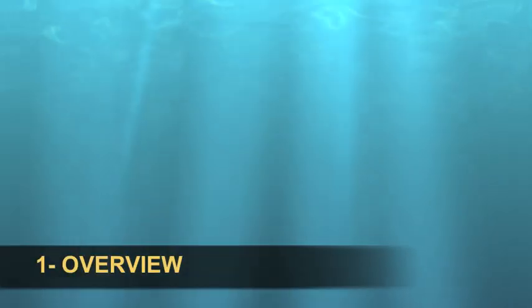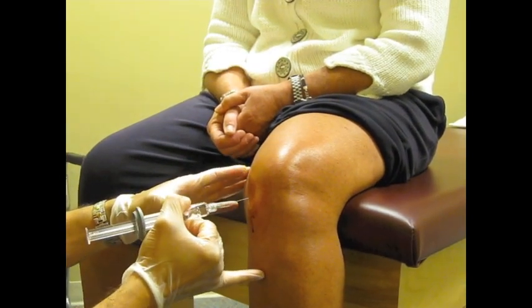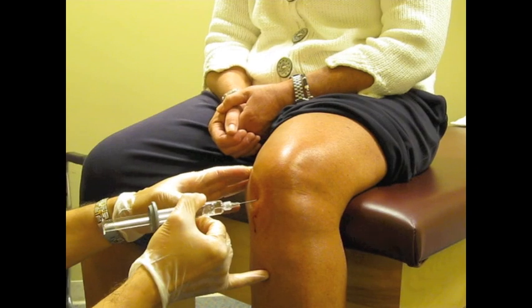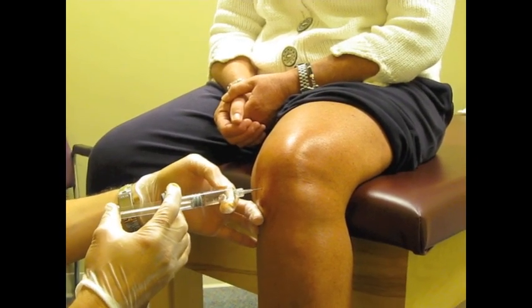This video will review two techniques for knee joint injections. Intraarticular injections and aspiration of the knee are common and useful procedures for daily practice. Both techniques are similar, but they have different indications.